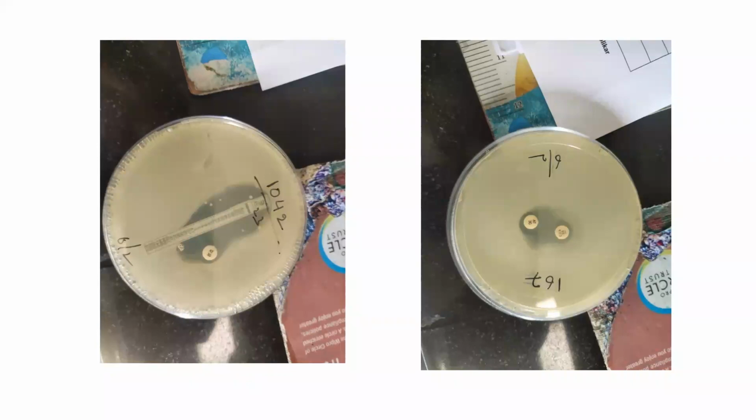If you come to the first picture, there is an E strip, for the ceftazidime avibactam, and there is an aztreonam disc next to it at a certain fixed distance, and then you can analyze it. Basically, you can see there is a very small aztreonam zone on the outer side, away from the E strip.